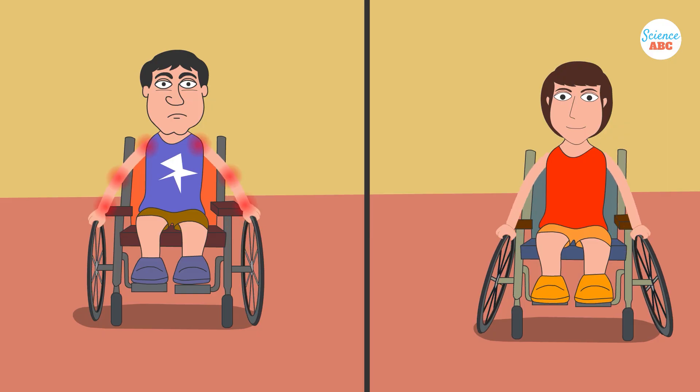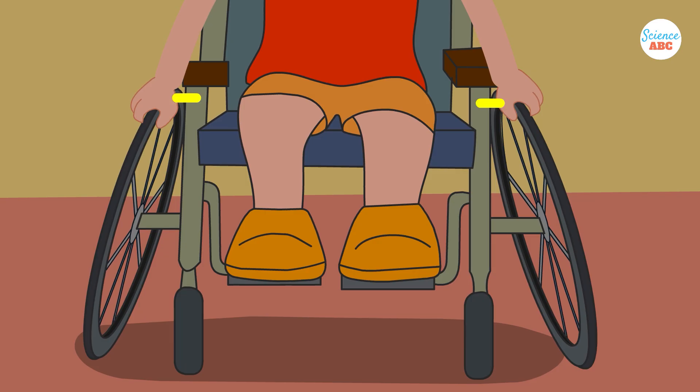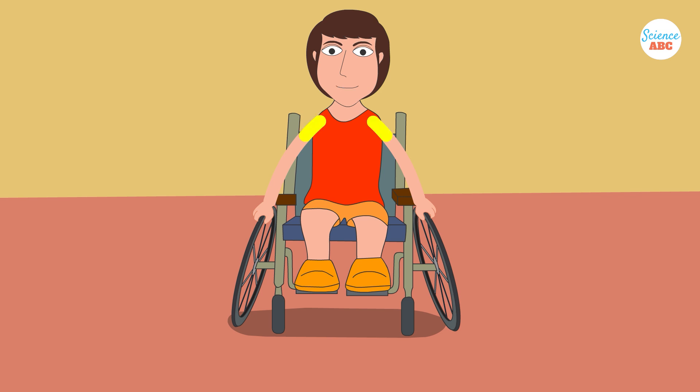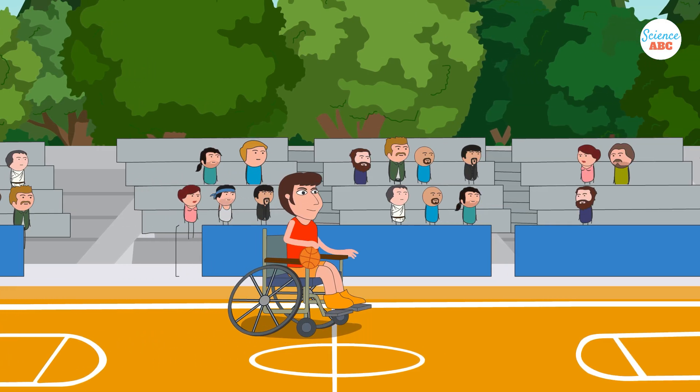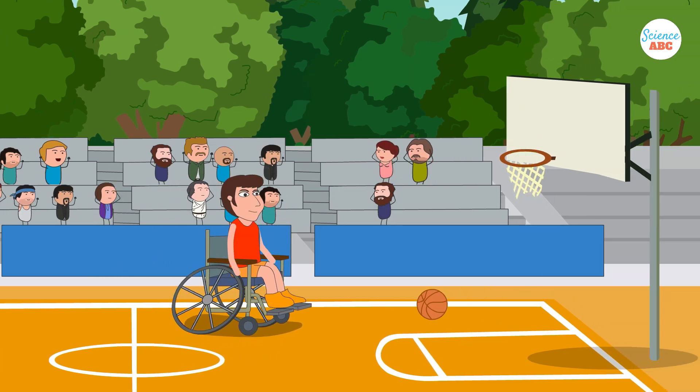Cambered wheels also help reduce stress and physical strain on the user's arms and shoulders. The upper part of the wheels is closer to the user than the lower part, which aligns the user's shoulder joints more closely to the wheel plane. This makes it easier for the user to push the wheelchair with less effort, allowing them to use it for extended periods. This becomes almost a necessity in certain competitive sports, where every bit of energy counts and can make the difference between victory and defeat.